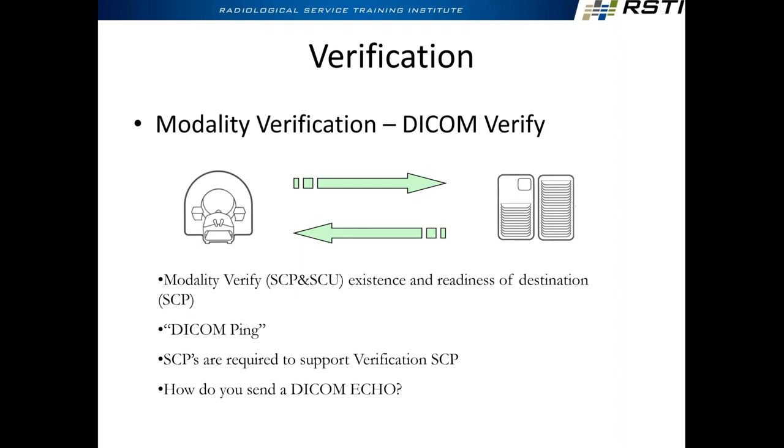Here's what I'm going to do. Latency, like a switch, or hardware switch, has latency. There could be timeout issues, and DICOM has built-in timeouts, they're configurable, and you see that in the logs. Because you see the SCU do something, and the SCP should respond right away. If it doesn't, I know that the SCP got it, and there's some kind of latency on this end. But yeah, there could be timeouts and latency issues as well, but those are more hardware and network type problems.